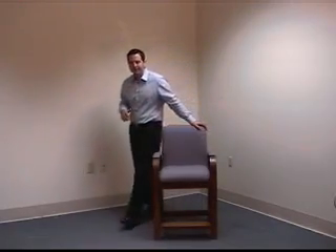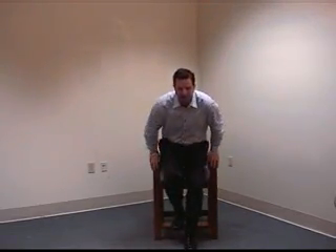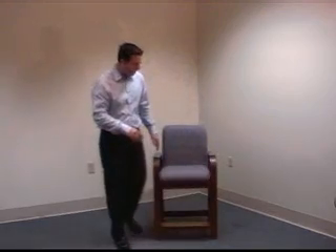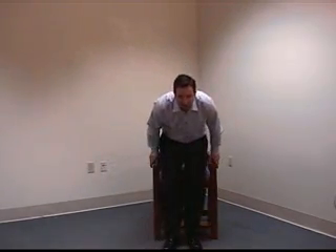The 27-inch high seat is ideal to help reduce stress and fatigue when both entering, sitting, and also exiting the chair. The curved armrests are also designed for assisting with entering the chair, are more comfortable when sitting in the chair, and also when exiting the chair.